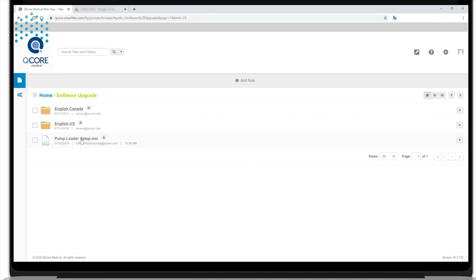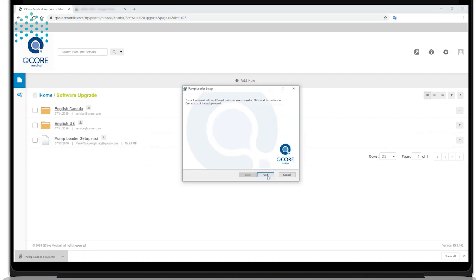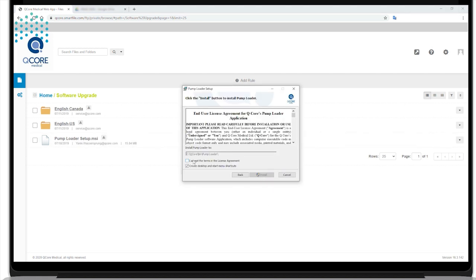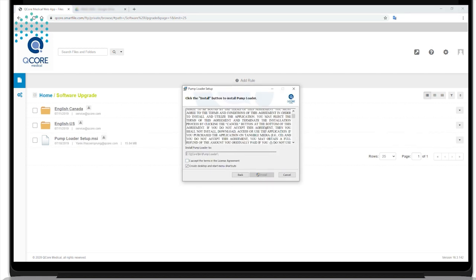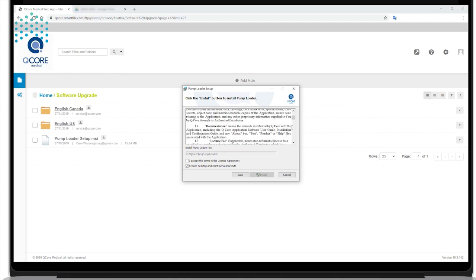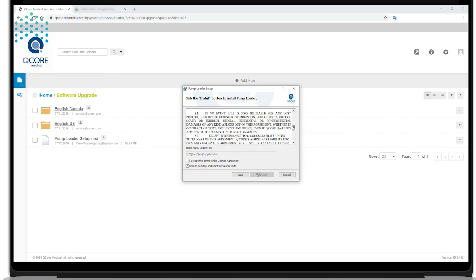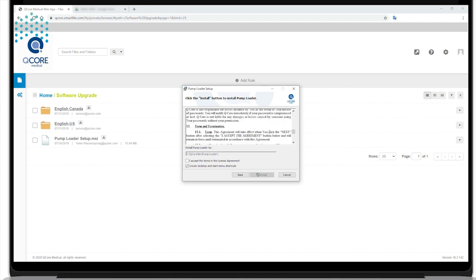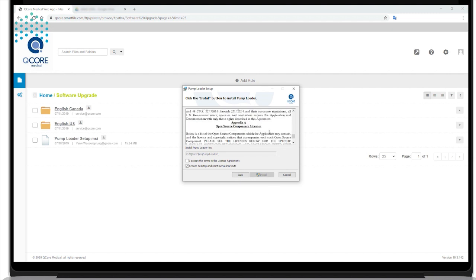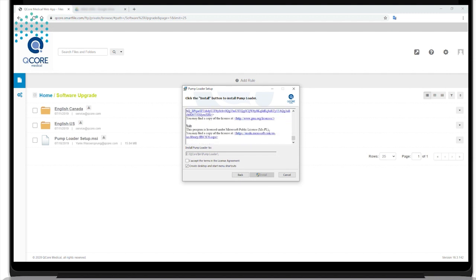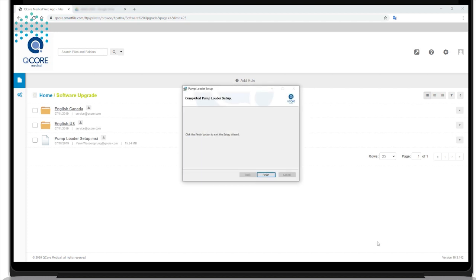To install the software, click Next to continue with the setup wizard. Read the QCore pump loader end user agreement and select the checkbox if the terms are accepted. Click Install to continue with the setup wizard. Once the installation is complete, click Finish.